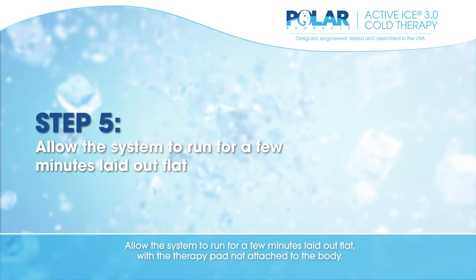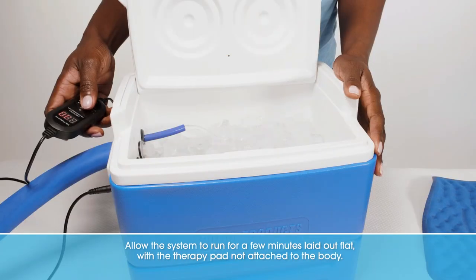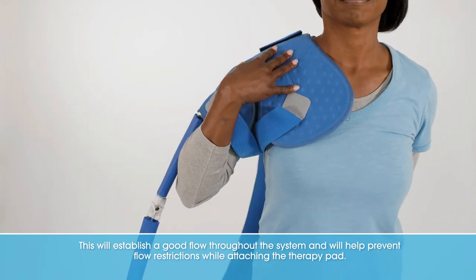Allow the system to run for a few minutes laid out flat with the therapy pad not attached to the body. This will establish a good flow throughout the system and will help prevent flow restrictions while attaching the therapy pad.